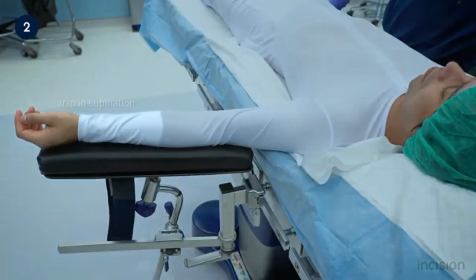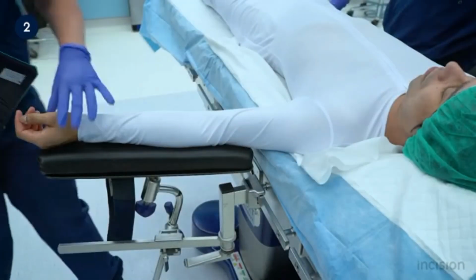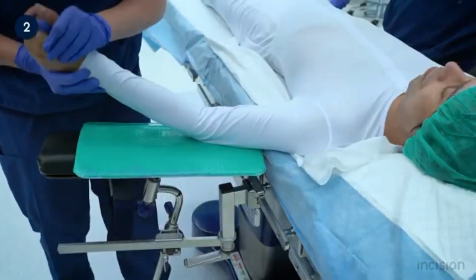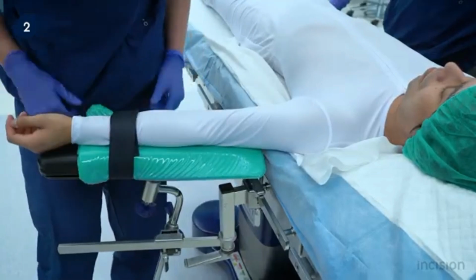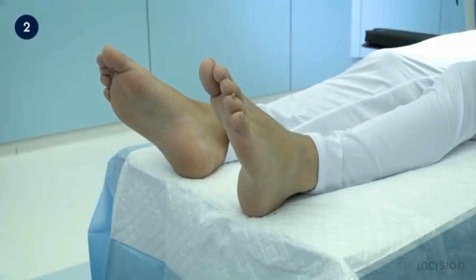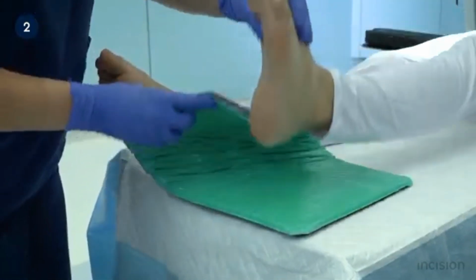Take note also of how the arm is kept in supination, preventing potential compression of the ulnar nerve at the medial epicondyle. A further protective measure is the placement of a gel pad between the arm and the arm support. Safety straps are then used to secure the arm to the arm support. In this position, the heels are also at risk of pressure complications. For this reason, a gel pad is placed between the heels and the surgical table, as shown.